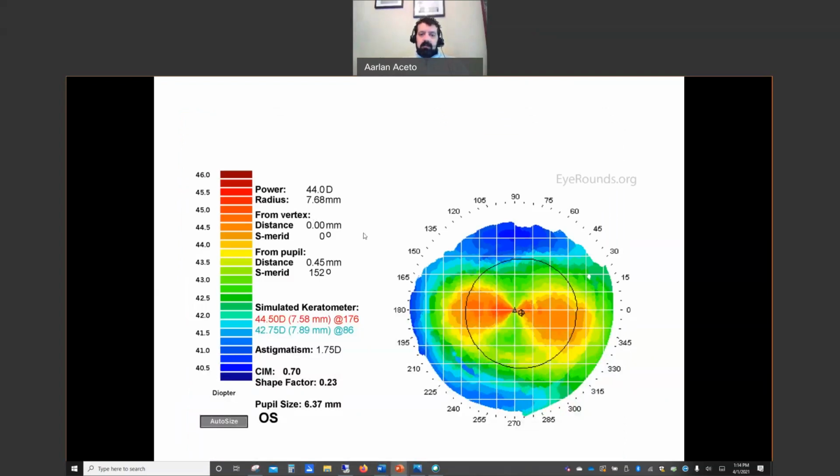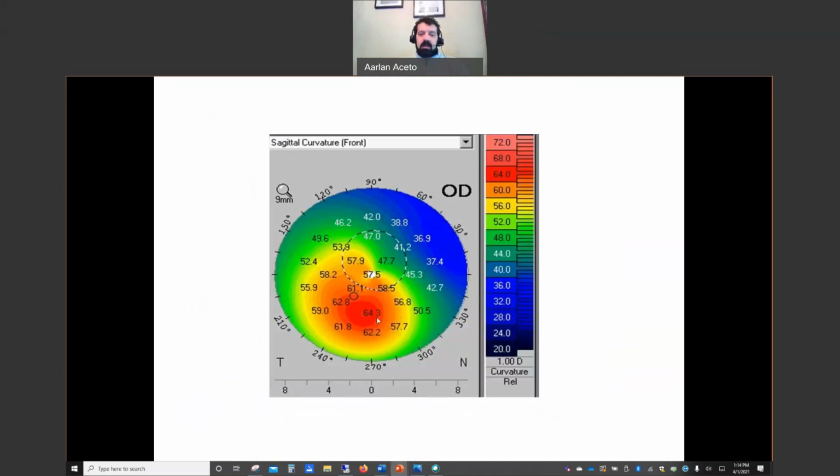So let's keep going here. Remember with that little demonstration we had, if it's steeper here, not up in one meridian or another, this means there's an isolated abnormality. And remember what we said about the average corneal curvature in previous lectures being about 43. Well, if the average is 43, and here I have this huge bump of 64, this is a cone-shaped area off-centered, and this is what we would call keratoconus. And it's a textbook case of a very severe case of keratoconus.